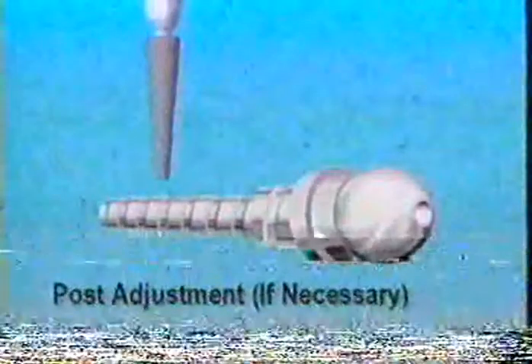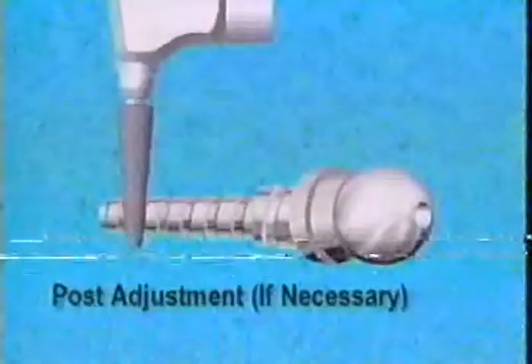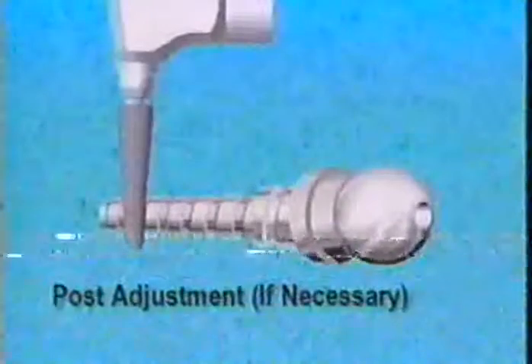Shorten the post apically to allow full seating of the flange, using a fissure burr or diamond. The grooving drill is inserted into the canal, then pushed against the canal wall and rotated in a circumferential manner. The drill will create mechanical retention grooves in the canal wall for the cement, greatly increasing the overall retention of the post. The canal is now washed with water and air dried to remove any dentinal debris.